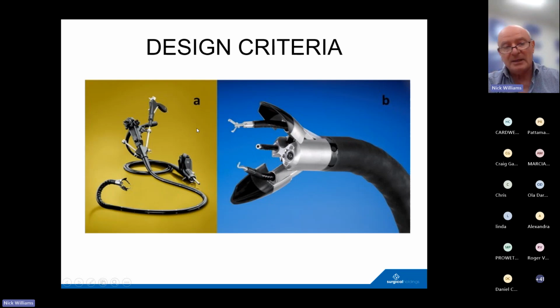This was actually a prototype, but I've kept the picture because I thought it was very useful in showing some of the innovation that can be done with these instruments. And certainly as therapy is done more and more, I hope we'll start seeing more of this type of design. I think it's very elegant. And as you can see, the whole thing closes down.